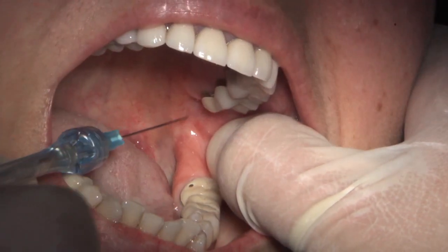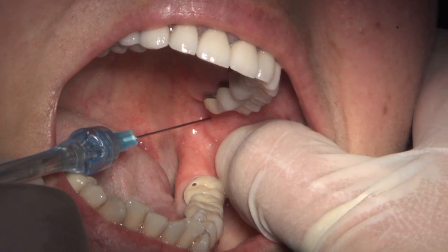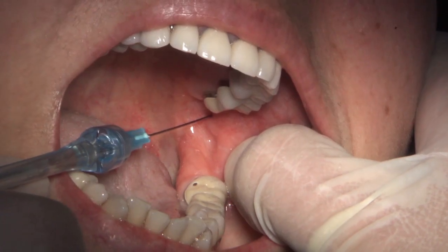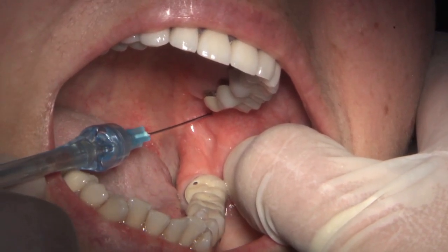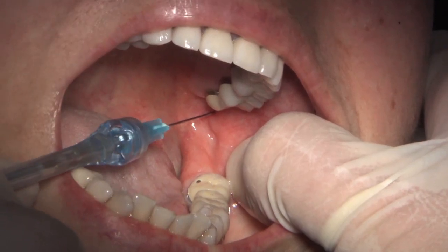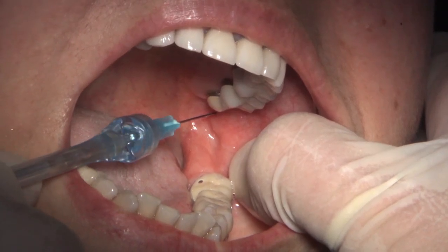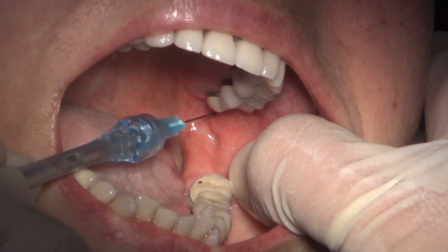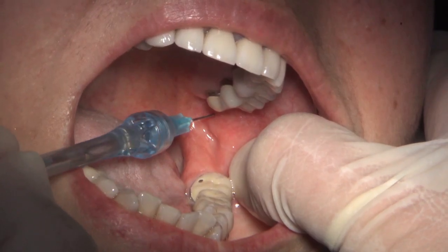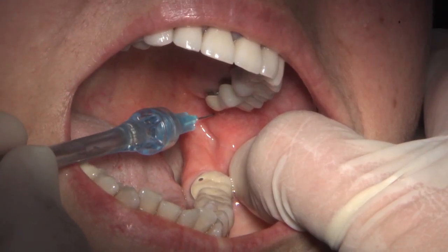Okay, Ana Maria. A little pinch here. Go ahead and start to twizzle whenever you're ready, and just keep your focus on where that location is near the condyle. Typically on a Gow-Gates like this, how much of the carpule will you use getting back to your target site? You've got about eight seconds before this is going to automatically start into cruise, and I find that's adequate to get there. My guess is I'm anticipating you're going to have contact here shortly. Right there — I do. And that's about three-fourths, which is traditional for an IA.